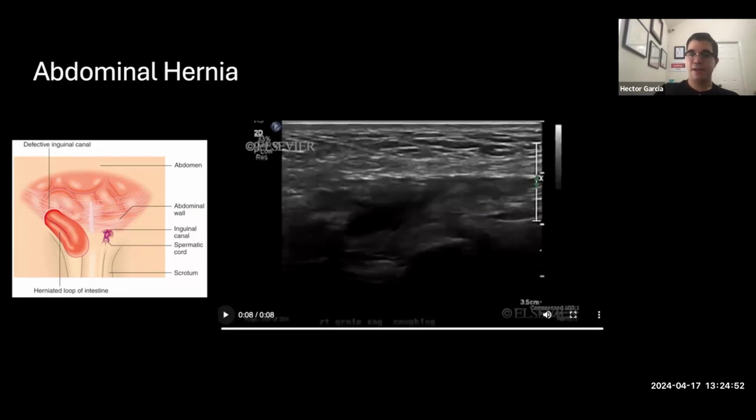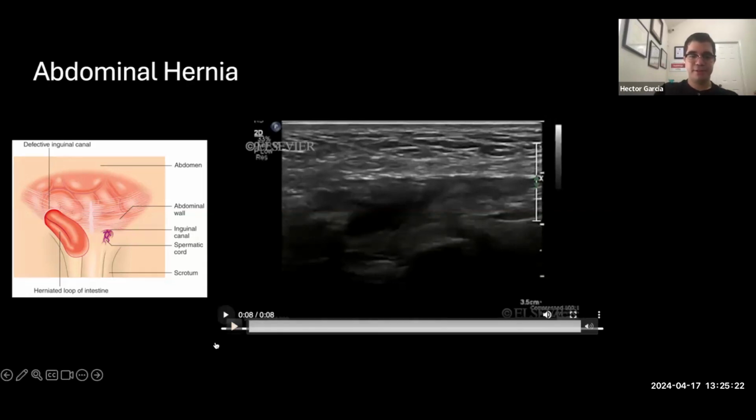Okay, and then something that they usually like to test, I know by the mnemonic, MDs don't lie. MDs meaning medial, that is middle: the direct hernia is medial to the inferior epigastric vessels. Direct hernia, middle to the inferior epigastric vessels. And for the lateral part of the mnemonic, the indirect hernia is lateral to the inferior epigastric vessels. That is the other piece of information for exams.